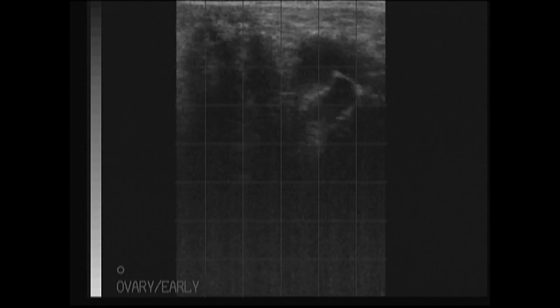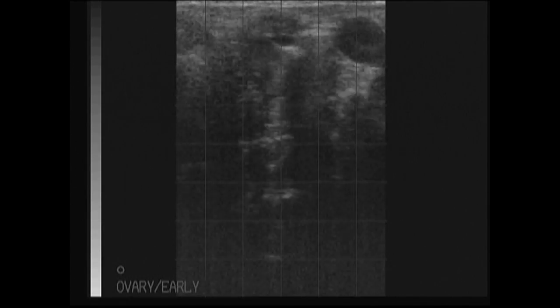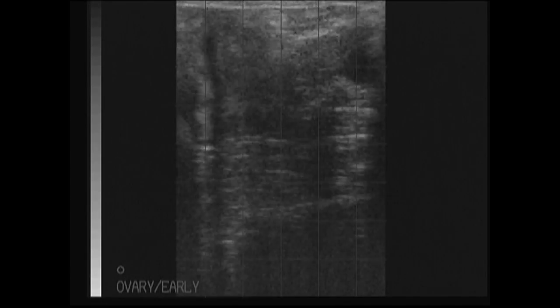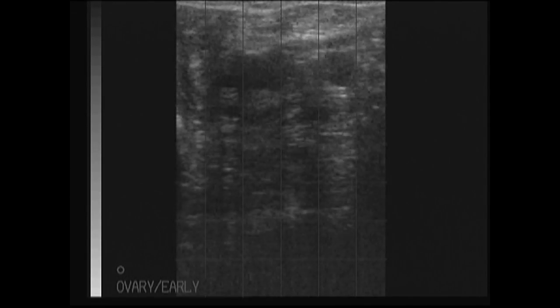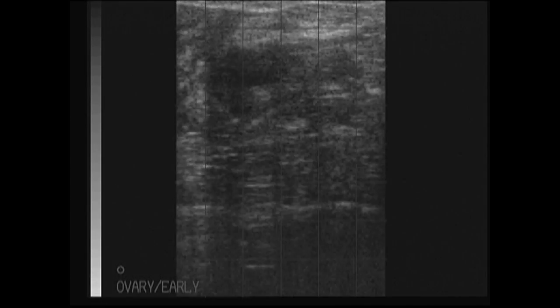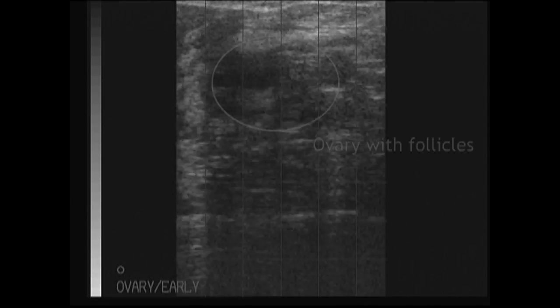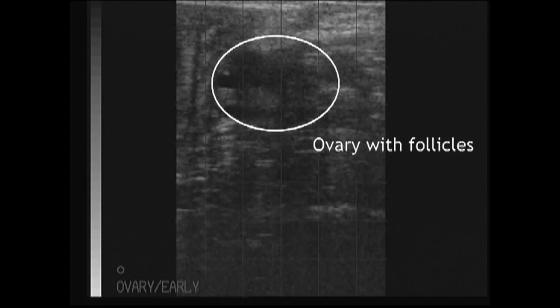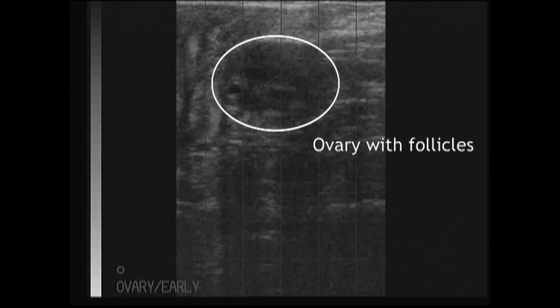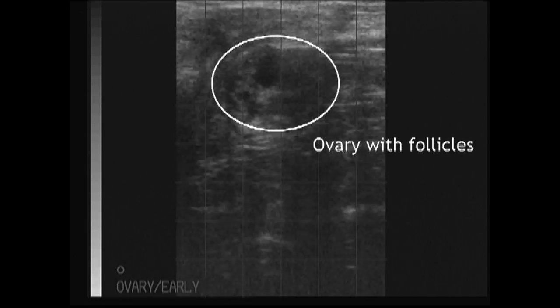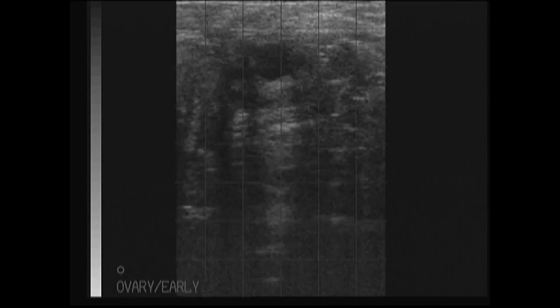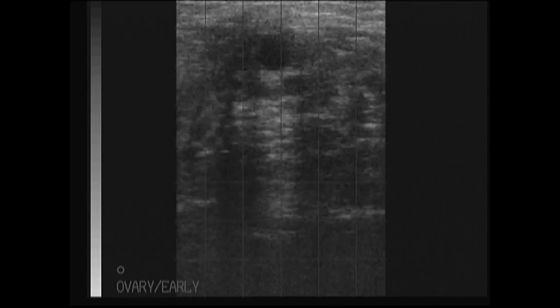We will then look at the ovary on this side. The ovary just starts to come into view here as a spherical structure with several dark or anechoic fluid-filled areas, and these are very small follicles on this ovary.